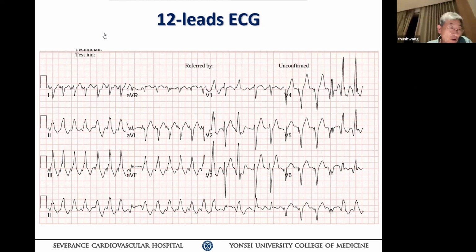Good morning. So this is a wide QRS tachycardia, and there is VA dissociation, and the morphology criteria fit, but I think it is a bit more peripheral. Where is VA dissociation? On the last rhythm strip.